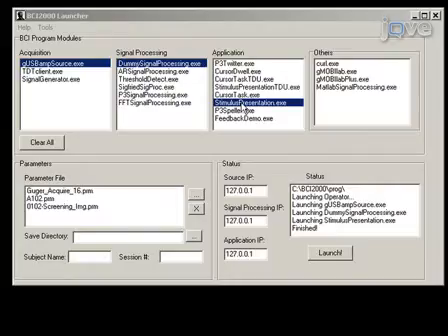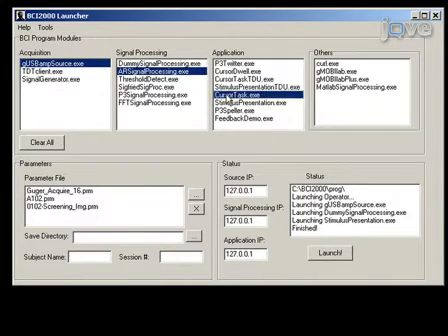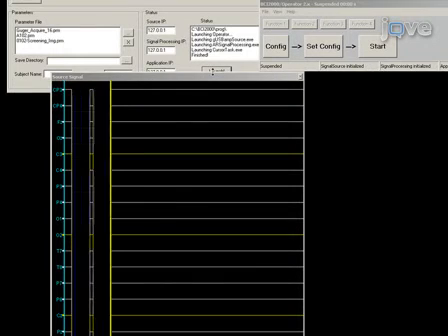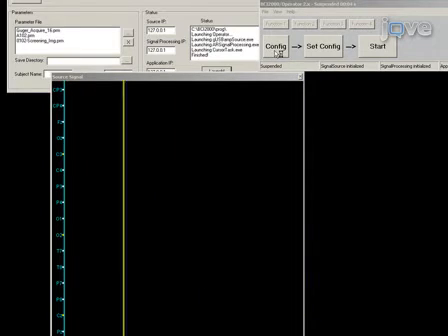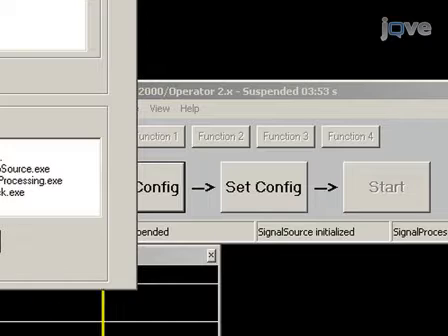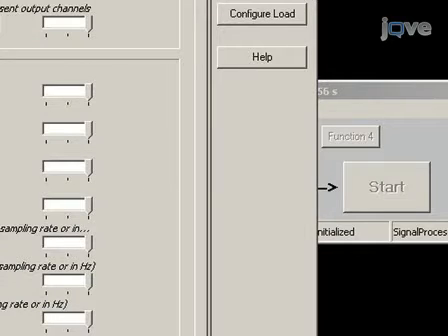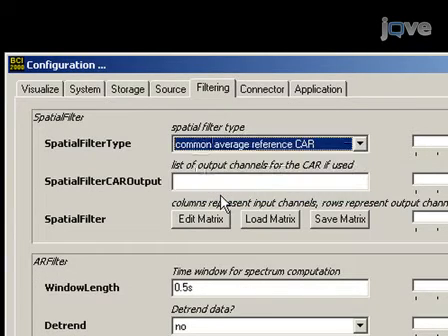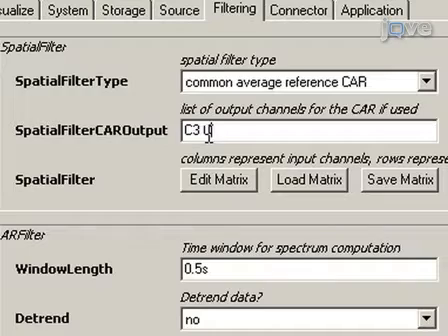Now that you've determined the features correlated with each imagined movement, it's time to set up the BCI system to use these features to control the cursor movement. First, configure the cursor movement session in the BCI 2000 launcher by selecting your amplifier source module, AR signal processing module and task module. Configure the spatial filter with a common average reference. To do so, press config in the BCI 2000 operator to bring up the settings list and press the filtering tab. Go to spatial filtering and change the spatial filter type drop-down box to common average reference or CAR. Under spatial filter CAR output, list the channel names or numbers that you selected in the calibration session.